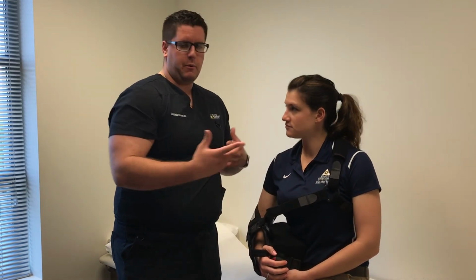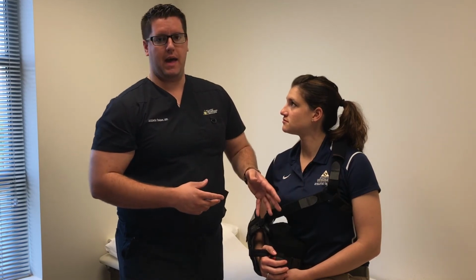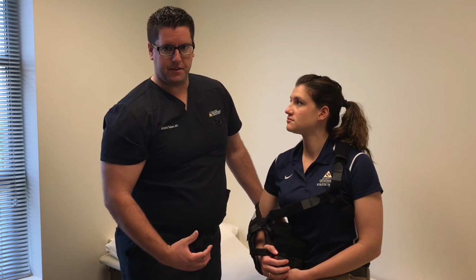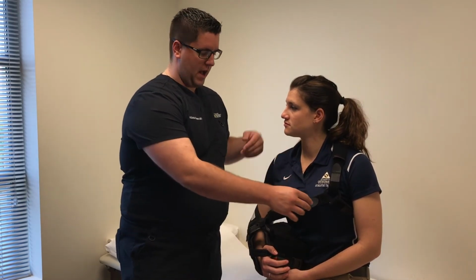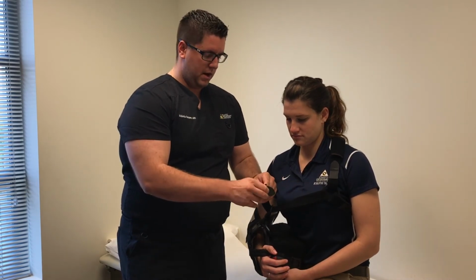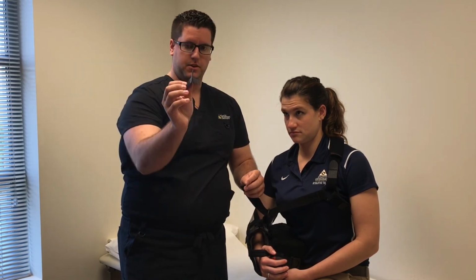And what we recommend is that you tighten up all the straps and not just strap A. We want to make sure that the sling is supportive and her arm's just not falling down to the side. So what I recommend doing is just readjusting all of the straps. And they're very simple, what we call alligator straps, or alligator Velcro. So it looks something just like this.